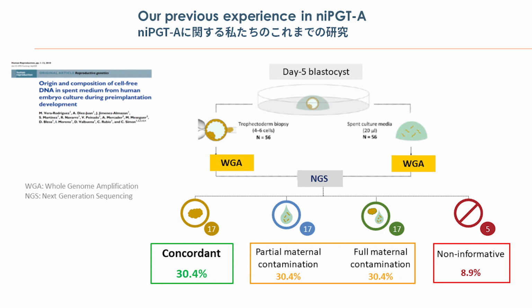And in this study, we were using EmbryoScope. And with EmbryoScope, you know that you need about 25 microliters of media. And in this study, we were collecting the media always on day 5. So we were changing the media on day 3, and we were collecting the media always at a fixed point that was day 5. And we were not cleaning the embryos especially. We were just doing our regular ICSI without cleaning the embryos especially, without paying attention to that.